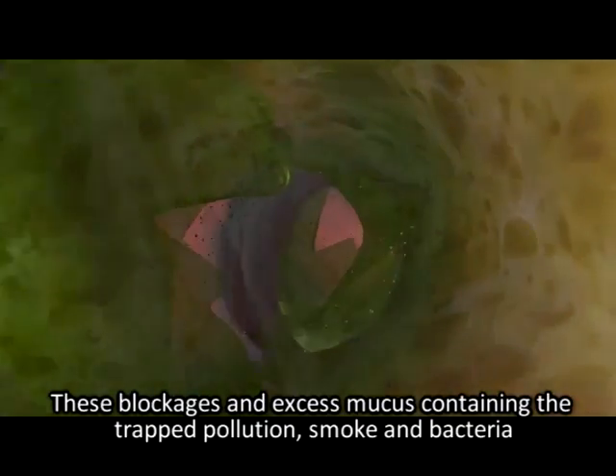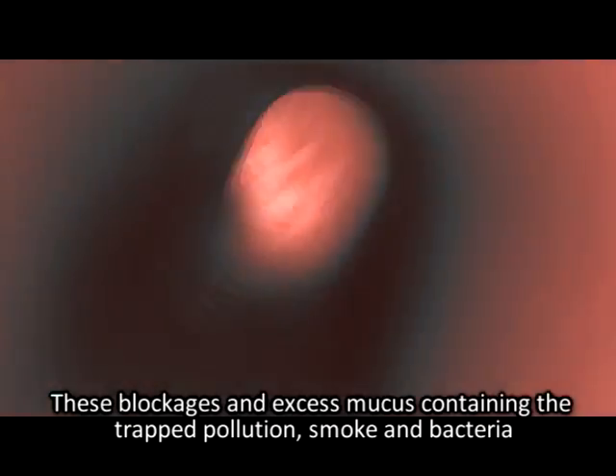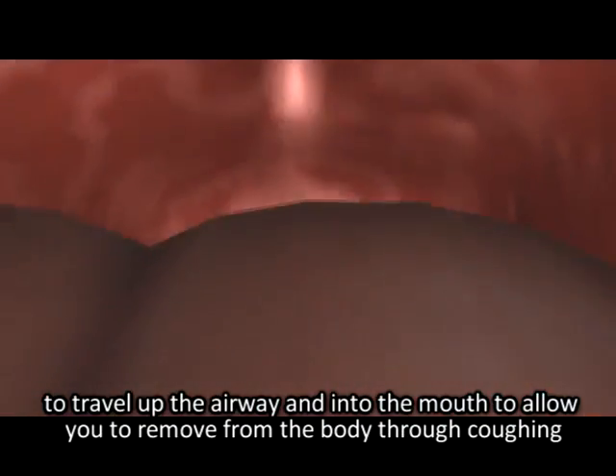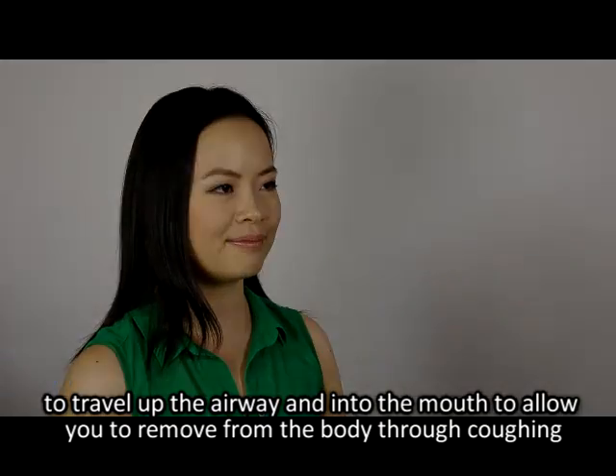These blockages and excess mucus, containing the trapped pollution, smoke and bacteria, travel up to the airway and into the mouth to allow you to remove them from the body through coughing.